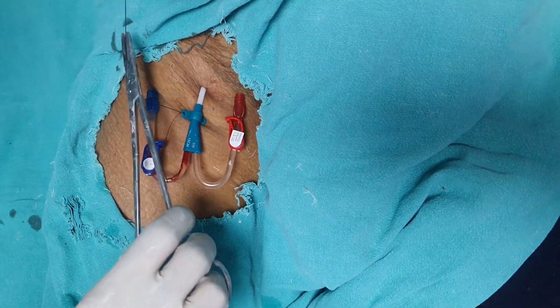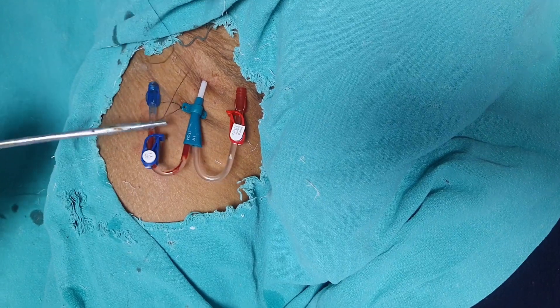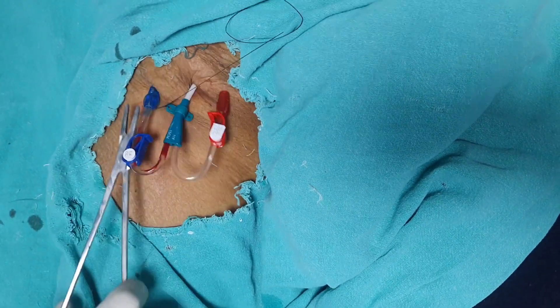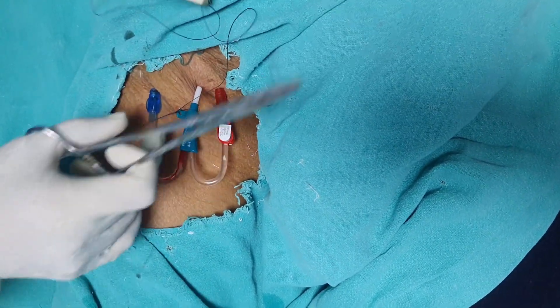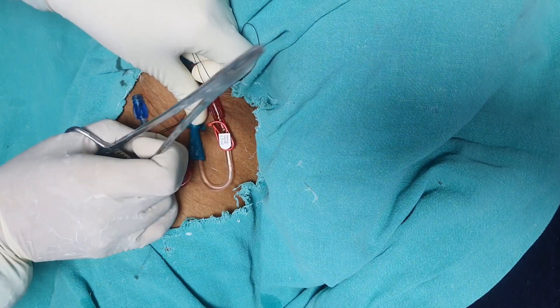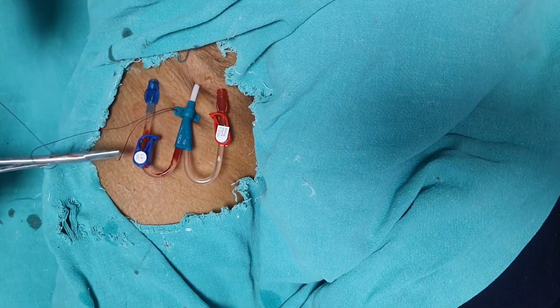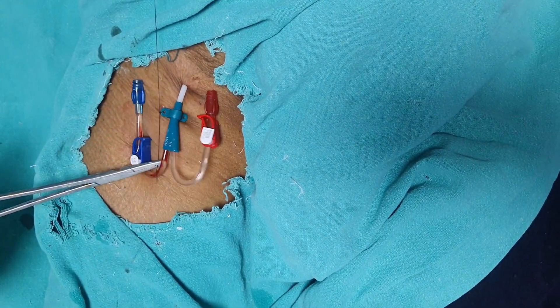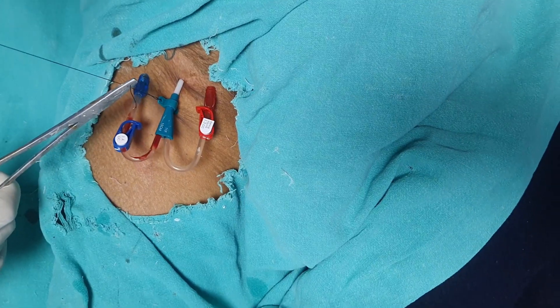We will give two sutures on each side, and in each suture we will give two to three knots — two knots is sufficient. So this is the right side and we will give the left side also.